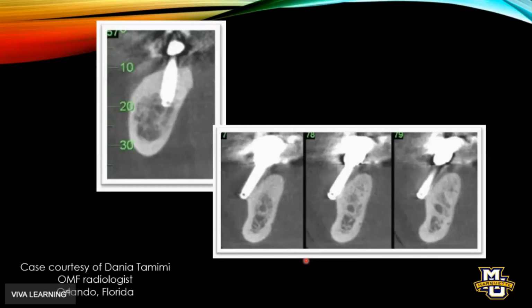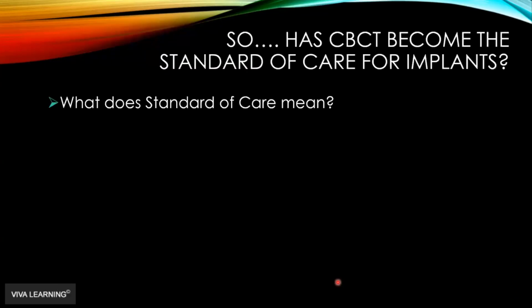And this is another case courtesy of my friend, Dr. Tamimi. So this is not obviously the outcome that you want to have. So the question is, has it become the standard of care for implants?